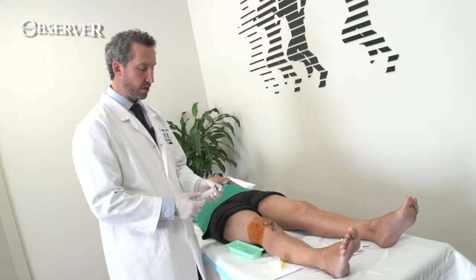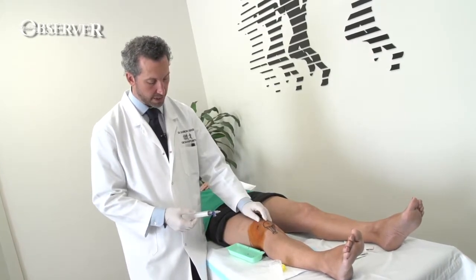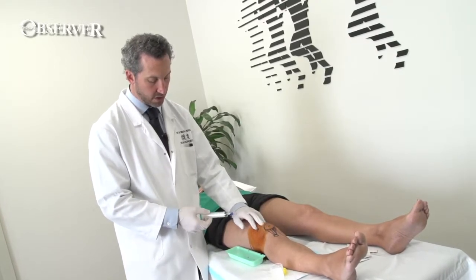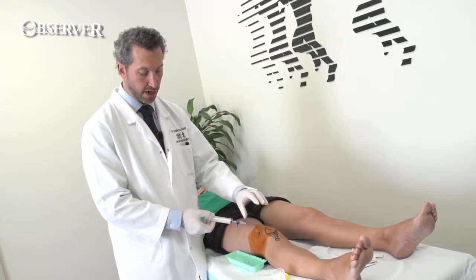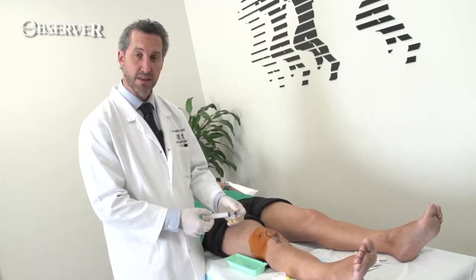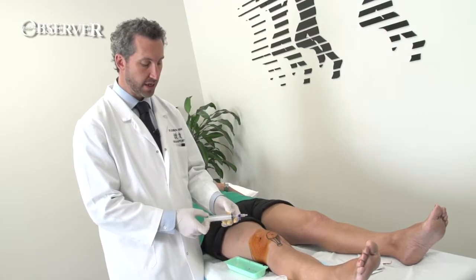Having created your sterile field, feel where the patella is, feel where the suprapatellar pouch is, and where you want to enter. You want your needle to go straight in, basically underneath the patella, where the fluid is separating the patella off from the femoral condyle. A large, wide-bore needle or even a 16-gauge cannula is very useful.